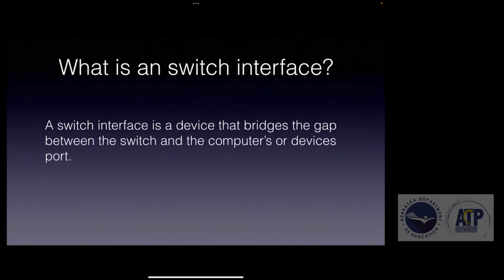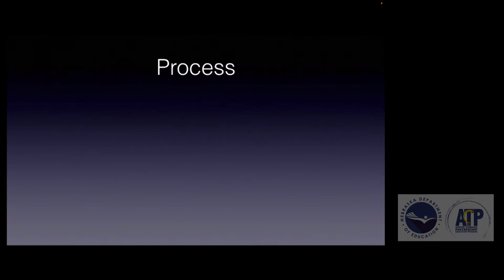So what is a switch interface? A switch interface is basically a device that bridges the gap between a switch and the computer or device's port. So it's the device that basically takes that switch click and converts it over to a keystroke that a computer or an iPad would understand.